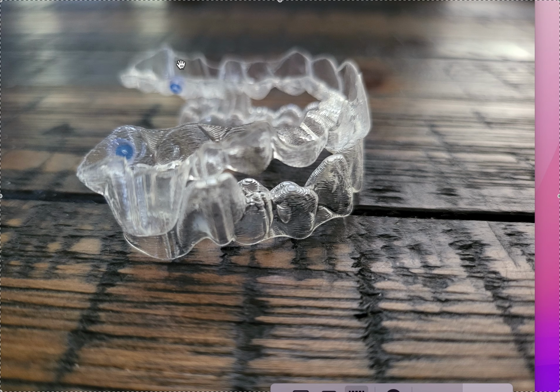Now, Invisalign First is a phase 1 product. All it's doing is straightening the front teeth and fixing the bite. That's all you're doing. There's still 12 more teeth that need to come in. It's not going to straighten those teeth. Invisalign First is just for front teeth and bite. That's it. It's interceptive. But I like getting the hard movements out of the way in the really, really young patients, the 5, 6, 7, 8, 9s. It's just so much easier.